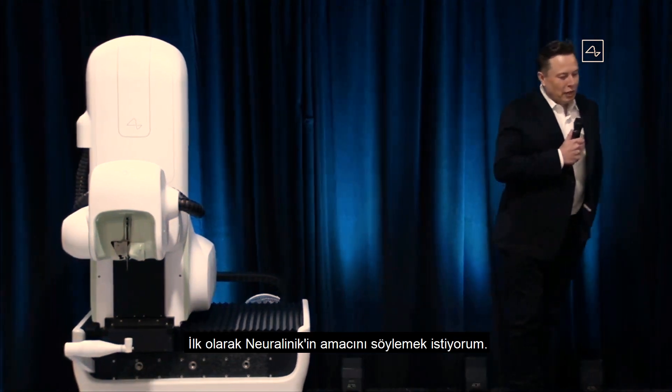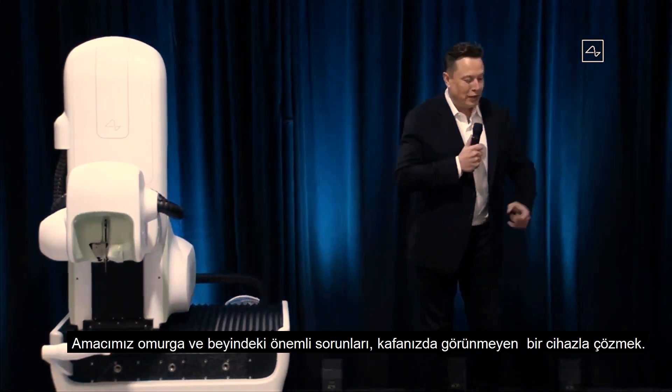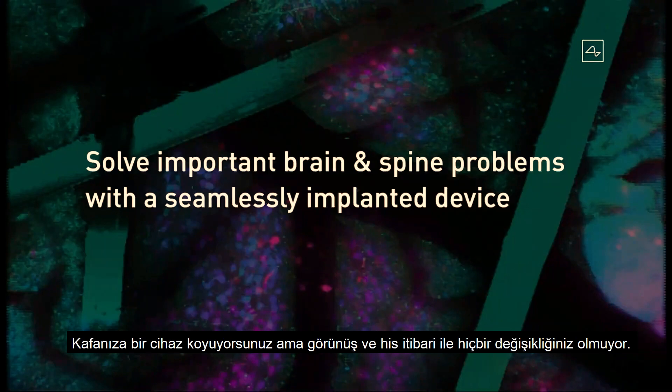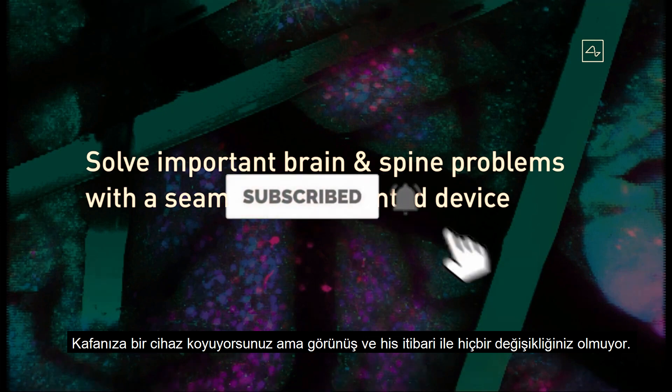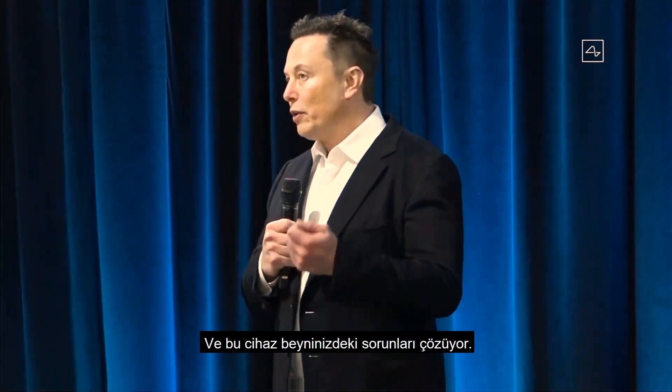I want to emphasize the purpose of Neuralink — what's our goal? Our goal is to solve important spine and brain problems with a seamlessly implanted device. You want to have a device that you can basically put in your head and feel and look totally normal, but it solves some important problem in your brain or spine.